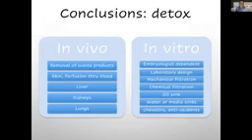So the conclusions are that the in vitro system needs detox help. In vivo, humans are able to remove waste products from the environment. They have skin, they have perfusion through blood, they have lungs, liver, and kidneys, so they have that system in place, and even at concentrations of parts per million they are able to remove most, but not necessarily all, of those volatile organic compound molecules. In vitro, it's embryologist dependent. The embryologist is in charge of the welfare of the embryo. It depends on laboratory design, mechanical and chemical filtration, oil sinks, water and media sinks, chelators, and antioxidants.